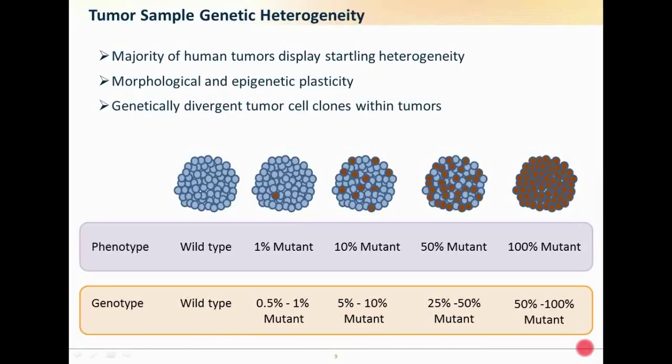And depending on the method you're using, you may be able to have a limit of detection down to 10% or 50% or 100%. With FISH or IHC, the nice thing is that you can see the slide, you can see the stain, you can normally see how well your method has worked. For molecular diagnostics, which we're not really going to touch on today, it's much more difficult to know and understand the limit of detection.